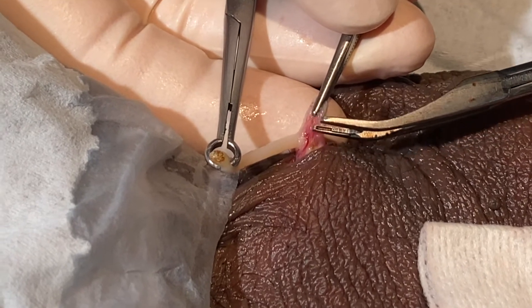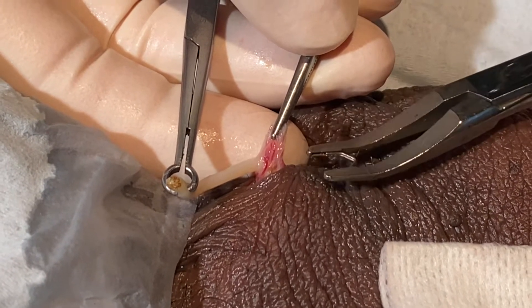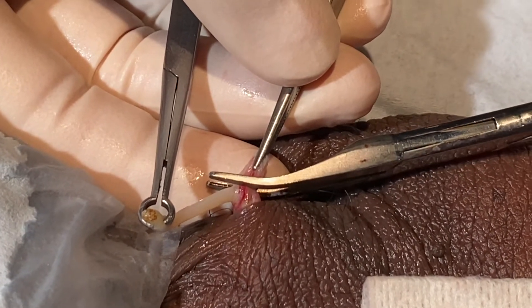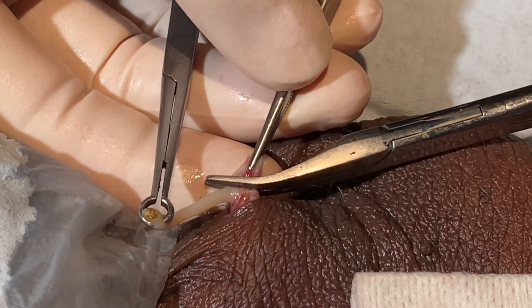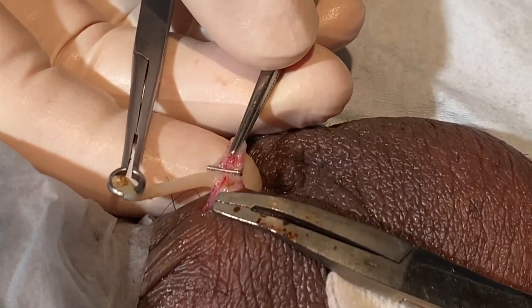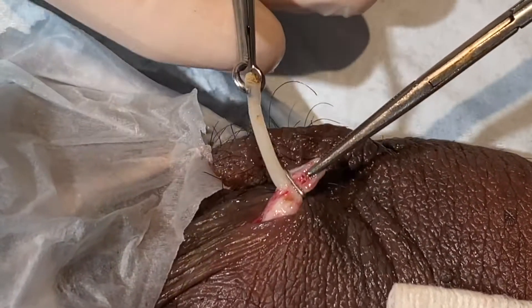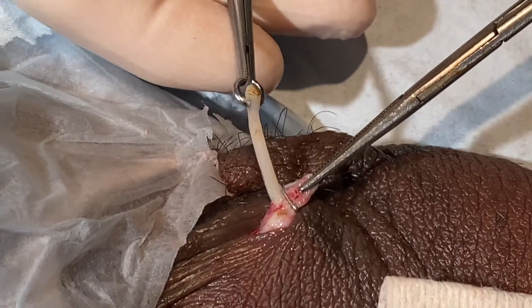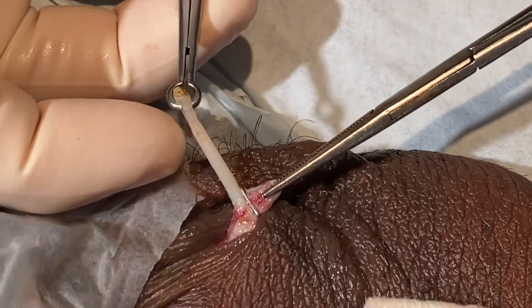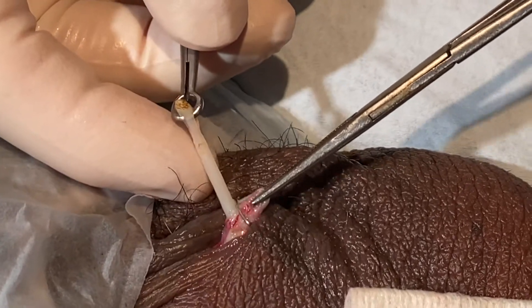I could put this hemoclip on like this, but that wouldn't pull the sheath tightly around the testicular arm. When you're applying either your suture or your hemoclip, you want to slide in close to the testicular arm so that the sheath is drawn around it tightly. Here you can see that the testicular arm can't fall back inside. We have at least two centimeters of end separation, and I really don't think this could fail — this would shock me if it failed.